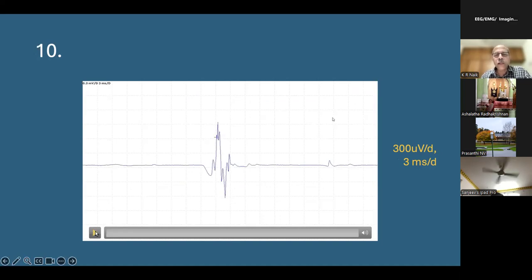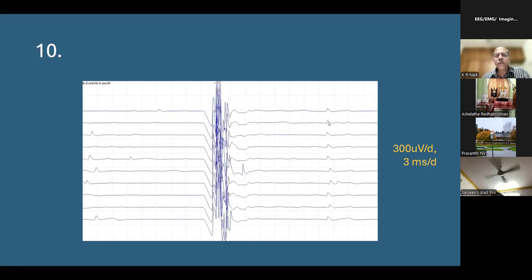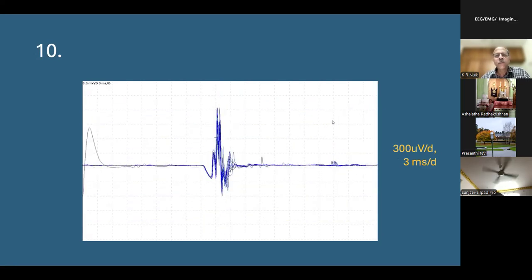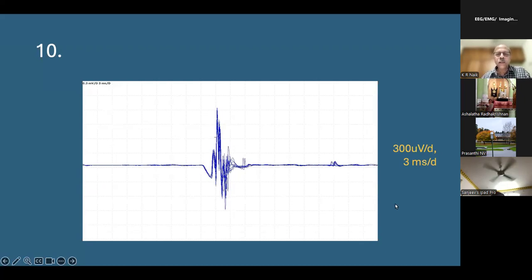Here you have to identify 3 findings in this video: normal phenomena and abnormal phenomena. Two findings are very, very evident. The third one may be missed, but let us see.